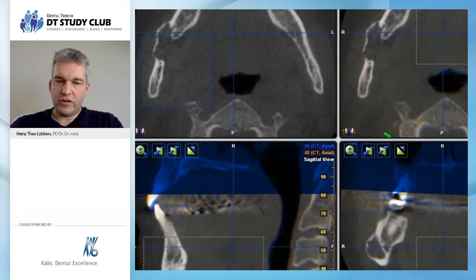What you can do, we saw that before, is to overlay this bone cyst. If you have any suspicion that there might be a change in the Stafne cyst, you can 3D fusion the data sets, and then you can see that actually this area here didn't move at all. And these red and blue areas here are just a result of movement of the patient.